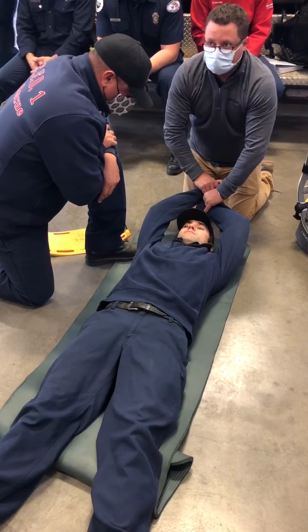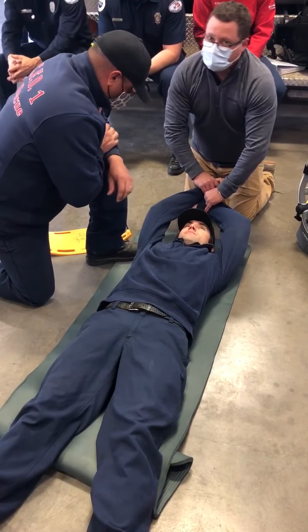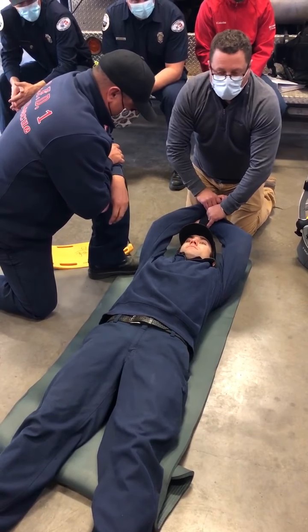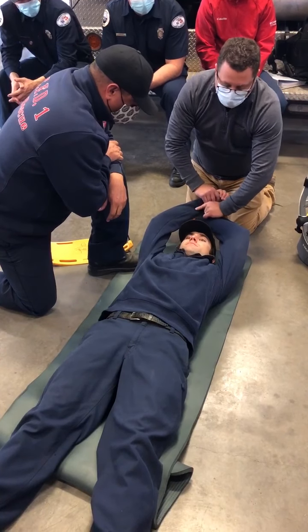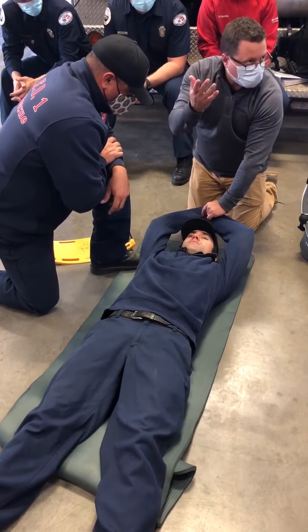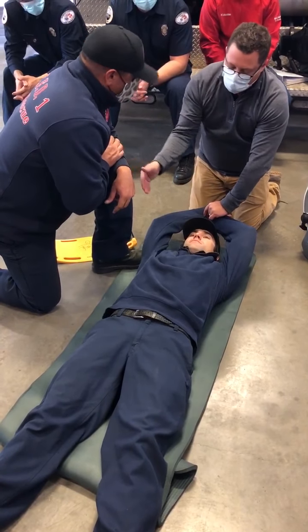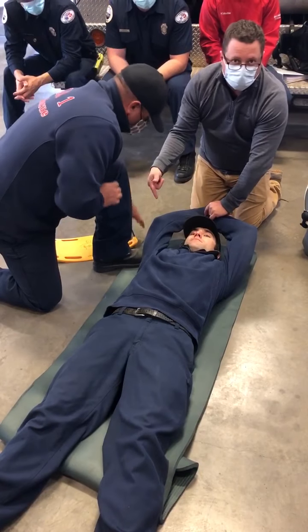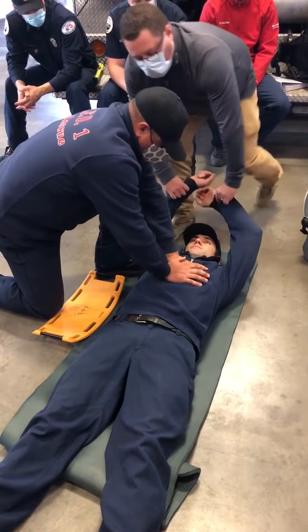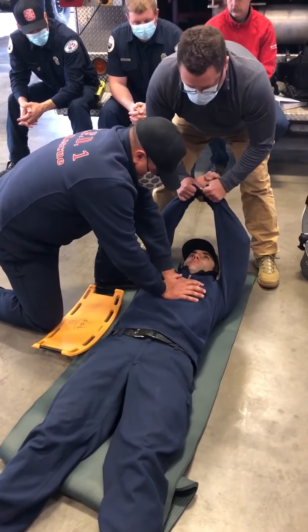Most people's rib cages are relatively the same size. It's the adipose tissue on the outside of that that varies. I don't like to do a big lift, and all I'm going to try and do is clear his shoulder blades. That's it. I'm not trying to get his head all the way off the ground. I'm just trying to get enough space for him to scoot that plate in. So you're still doing compression. We're going to time this and back plate in.